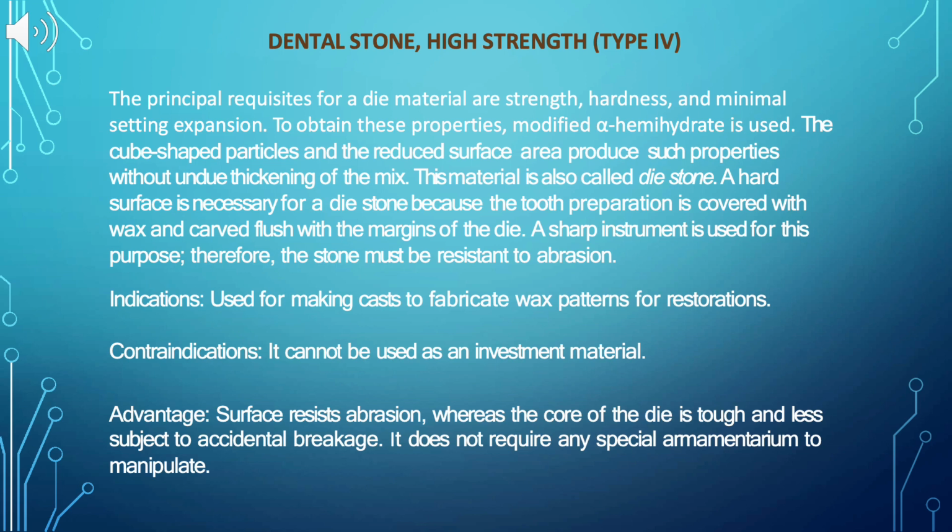Indications: used for making casts to fabricate wax patterns for restorations. Contraindications: it cannot be used as an investment material. Advantage: surface resists abrasion, whereas the core of the die is tough and less subject to accidental breakage. It does not require any special armamentarium to manipulate.